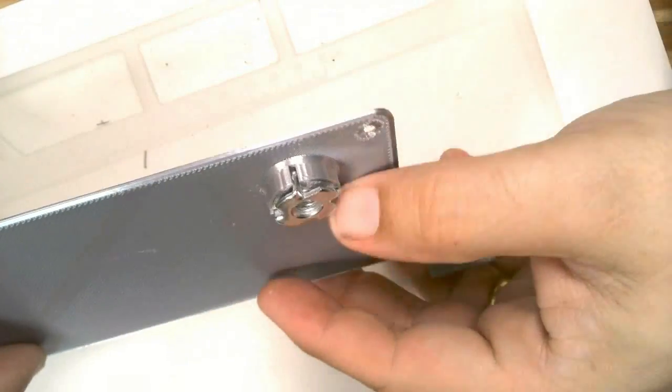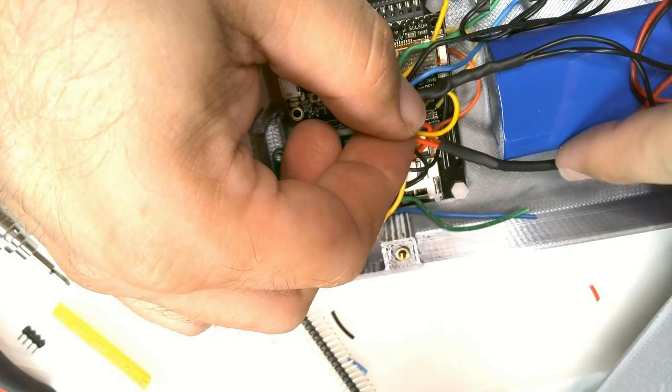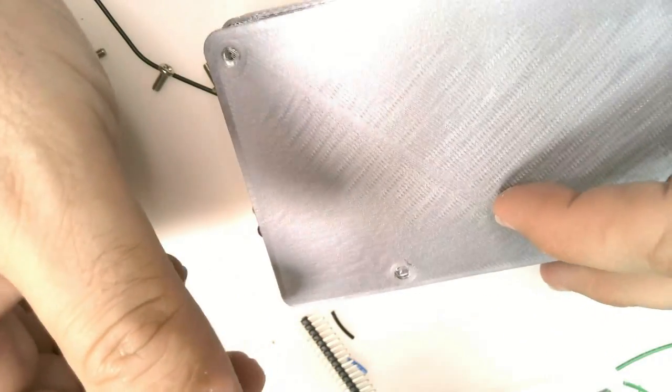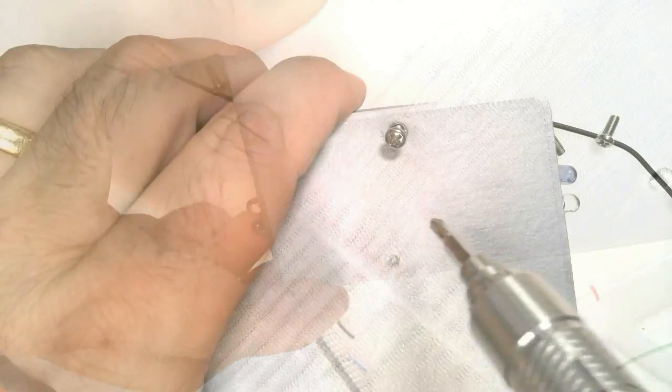Now we will secure the lid to the box. Make sure that all of the wires are tucked neatly inside so that they don't get pinched by the lid. Place the lid over the box and secure it with 4 M3 machine screws.